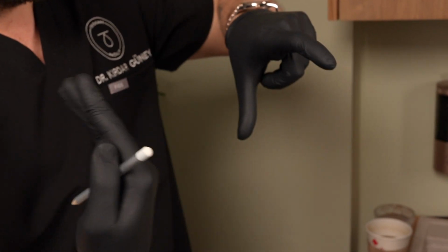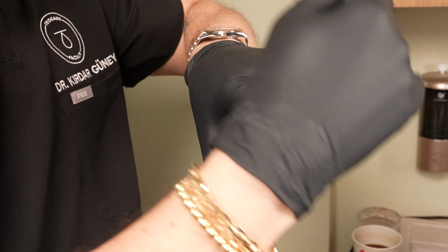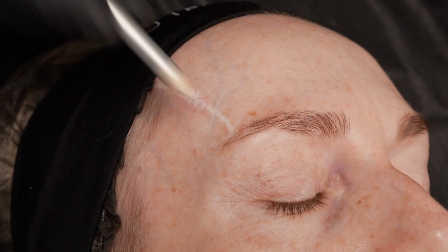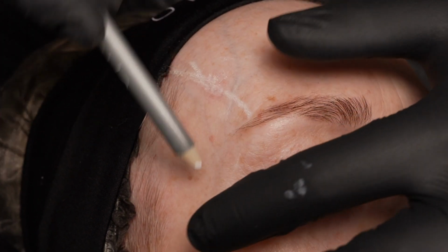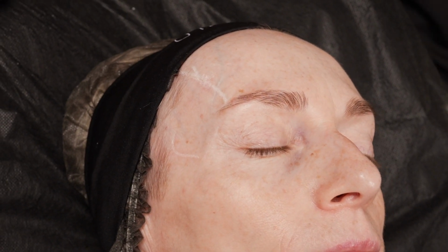Muscle, other fascia, everything gets together and they stick to this crest. And over it, it's the forehead. That's why stay in the forehead area, touch the bone, then you can go inside the tissues, all these temple tissues. So this is the limit. Be a little bit back from the limit and be careful over the veins. And your aim is to fill here. Then check, can I reach everywhere with my cannula or not? These are the targets. Okay.